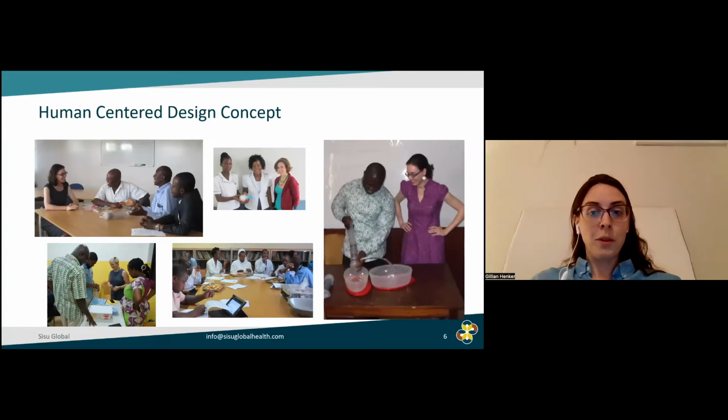Again, we're working with patients who are in surgery. So we do work a lot with the surgeons, the scrub nurses, the anesthesia staff to develop this technology, to look at usability, to look at where would this fit into clinical practice, who would be touching this and using this. So we did a lot of 3D printing prototypes, a lot of water demonstrations, a lot of abdominal simulations to say, hey, what is the scenario? What works for this group of clinicians?